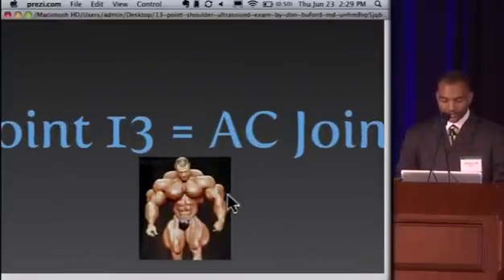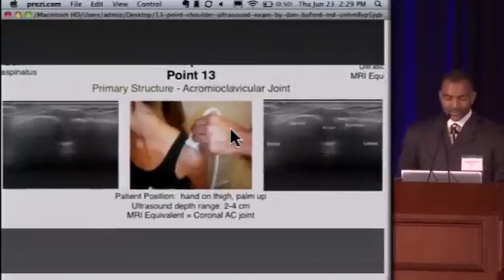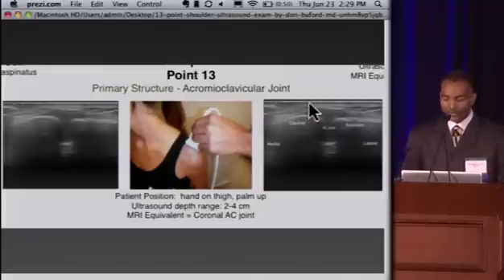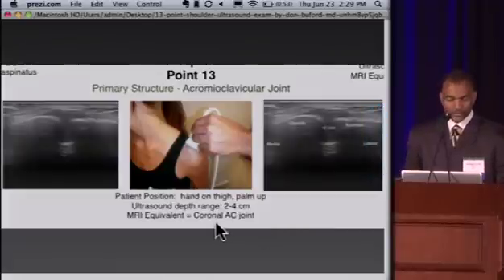Point 13 is the AC joint. We place the transducer directly over the AC joint, which is useful when patients have an oblique joint and you need to do an injection or want to check for fluid. You can't see the inferior aspect of the joint due to loss of signal depth, but you can see the clavicle medially, the joint capsule, any fluid around the joint, and the acromion laterally. That is the 13th point on the 13-point exam.